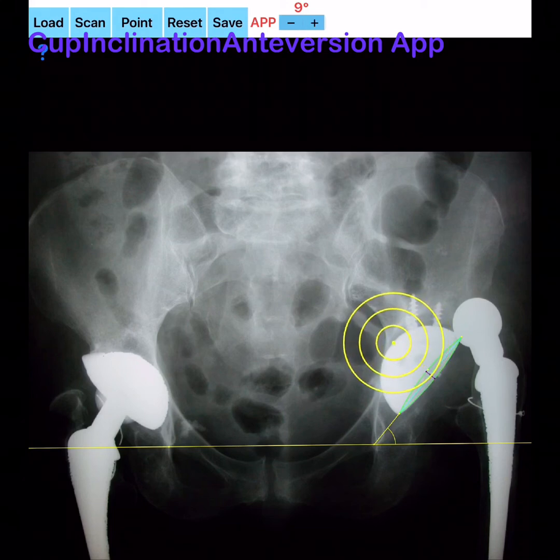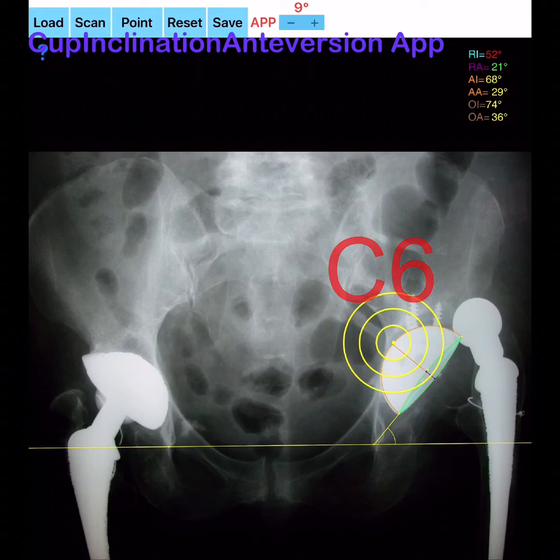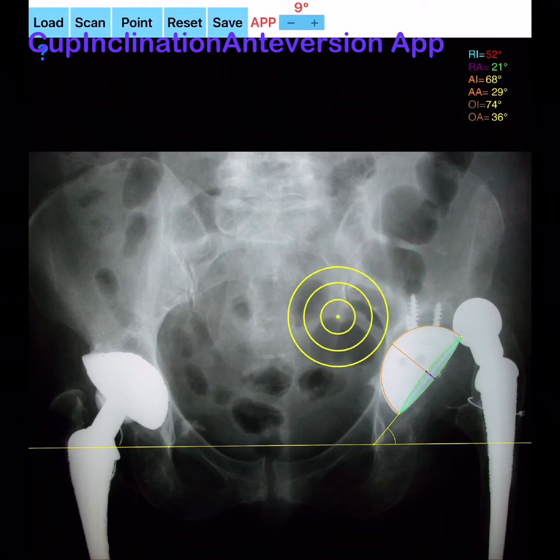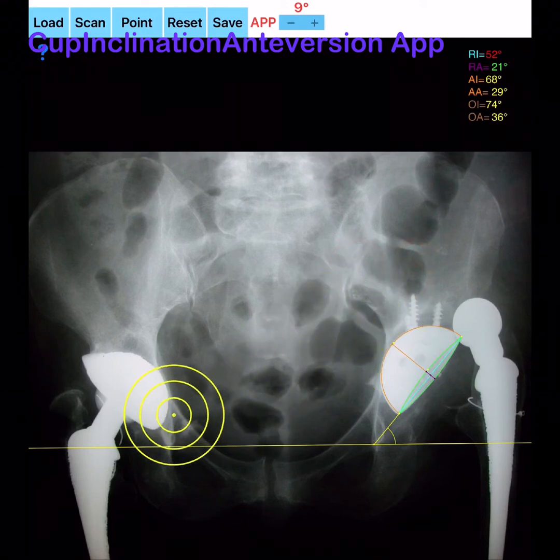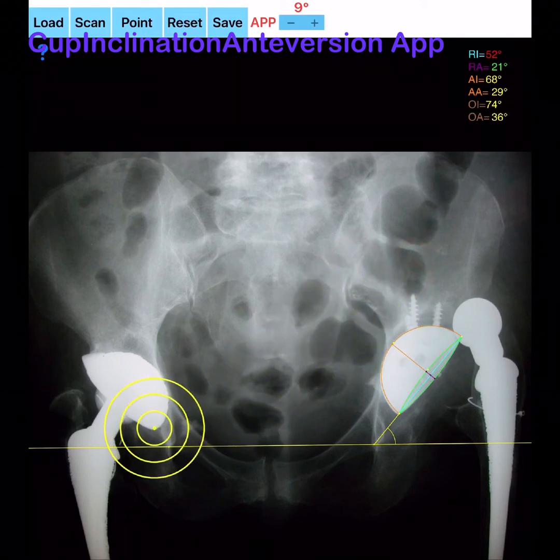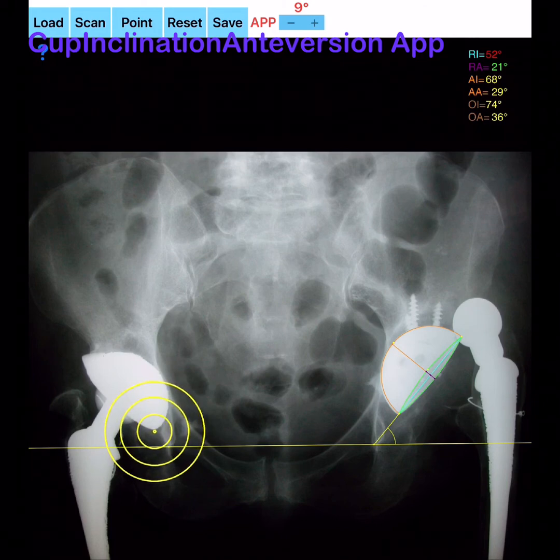Next, the most cephalad point of the cup is selected and by pressing the point button the C6 point is marked, and a perpendicular orange line to the long axis C3–C4 is drawn. The total length (TL) of the cup is depicted, and an orange perimeter of the cup is drawn.